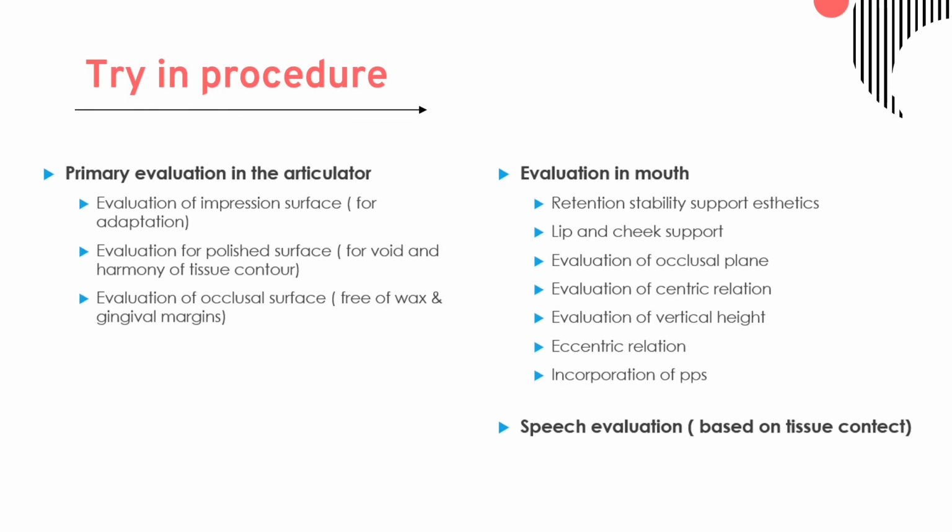When evaluating in the mouth, check for retention, stability, support, aesthetics, lip and cheek support, evaluation of occlusal plane, evaluation of centric relation, evaluation of vertical height, eccentric relation, incorporation of PPS.